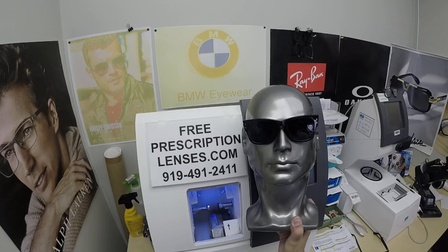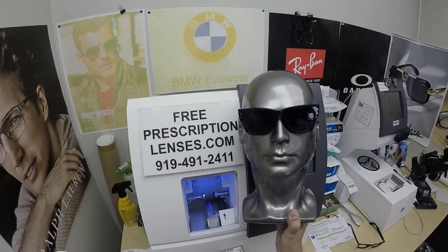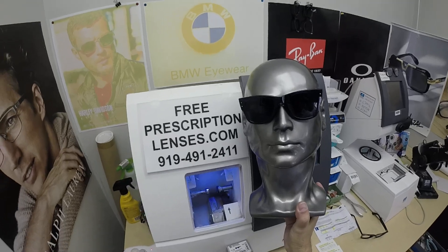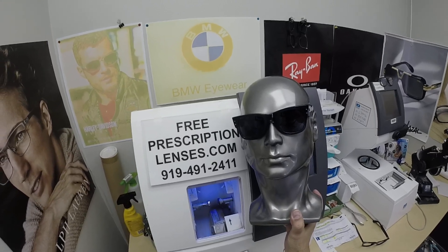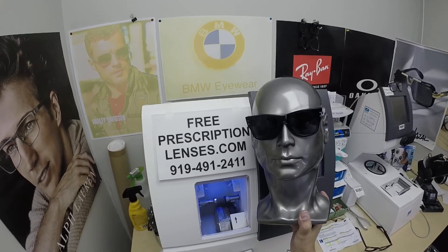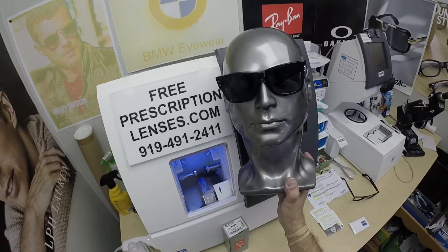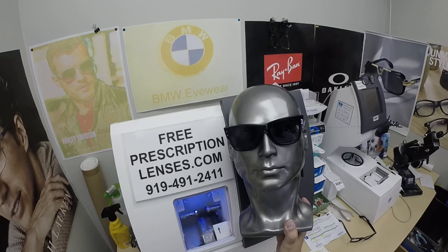There is the Zeiss Photofusion Extra Gray — Extra Gray only, no green, brown, or blue — designed for extra active people who spend extra amounts of time outside. Photochromic lenses were essentially the first blue blocking lenses. They will block up to 50% of blue light indoors and over 95% outdoors. For people who don't get photochromic lenses, Zeiss came out with Zeiss Blue Protect anti-glare, though ironically anti-glare alone does not block as much as just a clear photochromic lens with no anti-glare on it. So if you want the most protection, get any of the Photo Fusion lenses with Blue Protect.